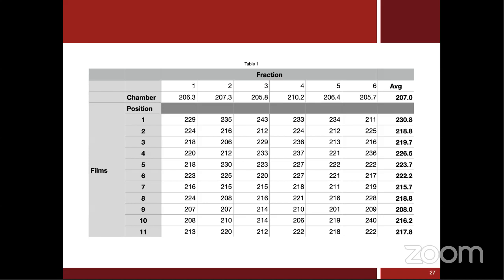But there is probably commercial software, and you just have to follow what the software recommends, what they want, and so on. So I cannot comment on this. I haven't done it for small fields. I've usually used it with IMRT, but small fields I haven't done. But I would think with small fields, you're also interested in the profiles. So then spatial resolution is an issue. That is something you have to think about when you use the software to do dosimetry with it.